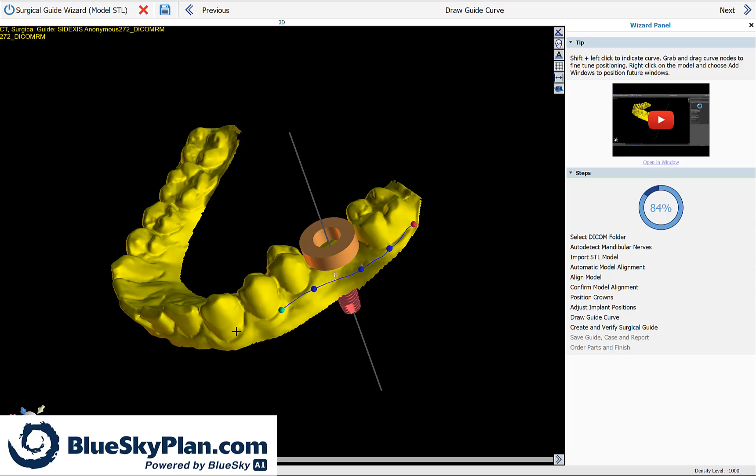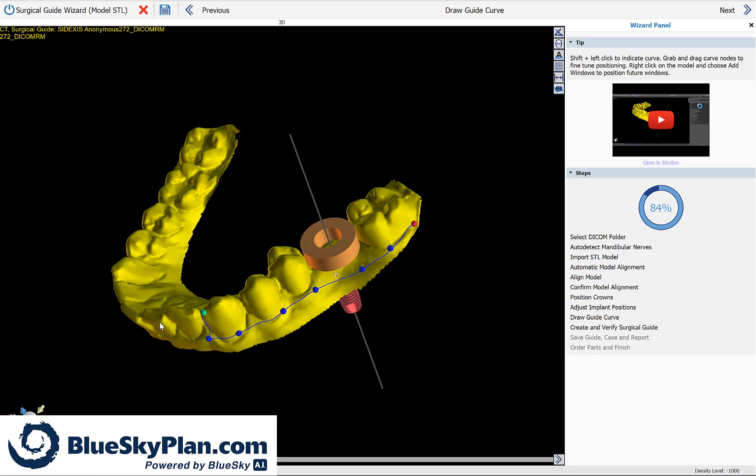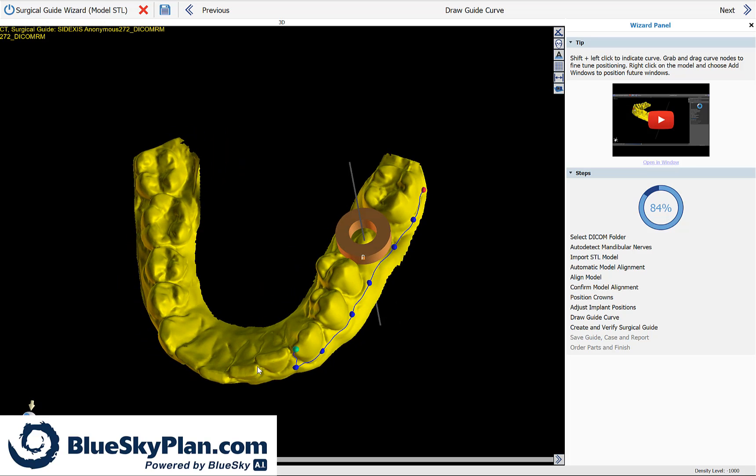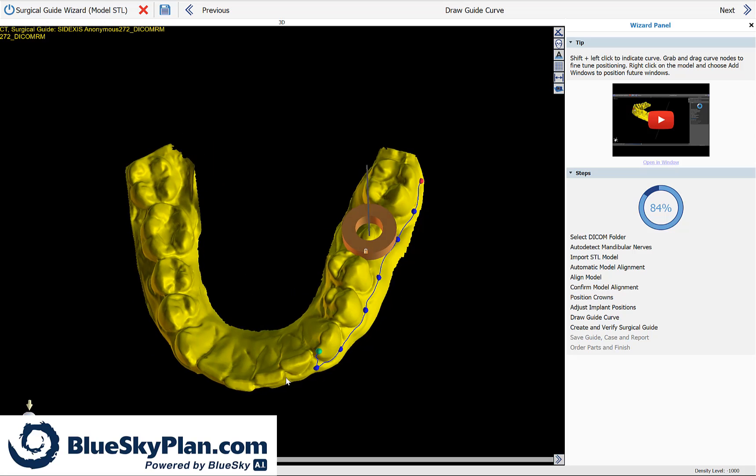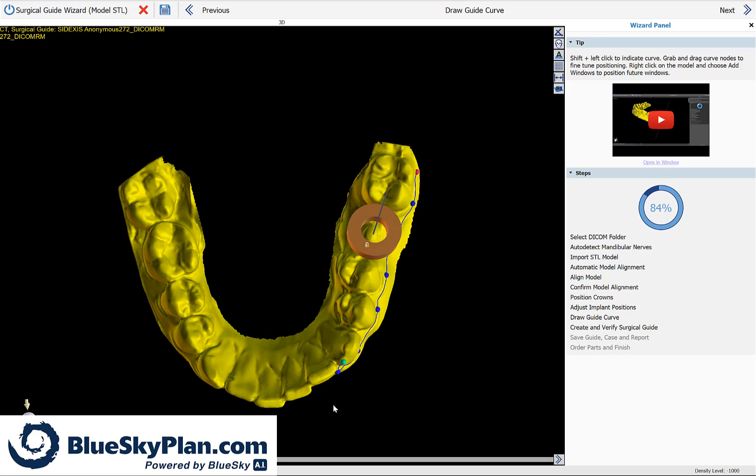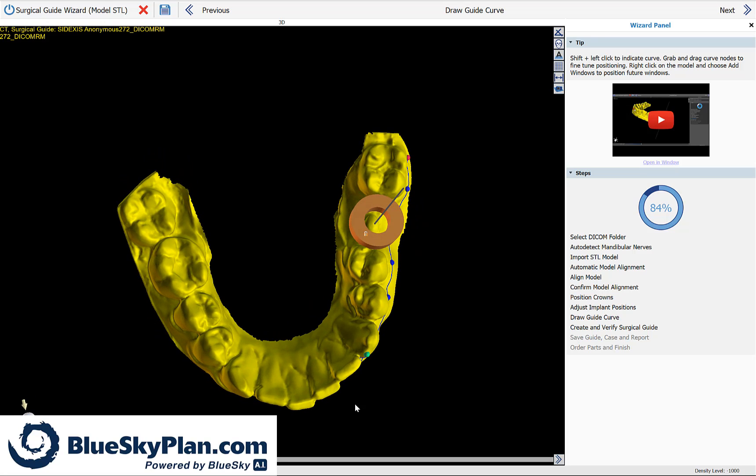Simply proceed to define the area on which the surgical guide should be created. When you need to rotate, let go of the shift key, rotate by grabbing and dragging with your left mouse button, and then once again, hold down shift while you continue to draw the surgical guide curve.